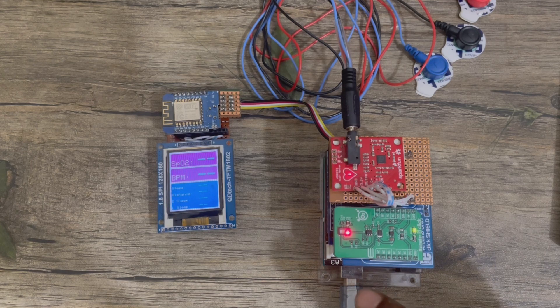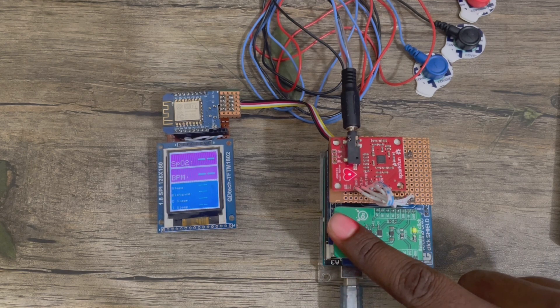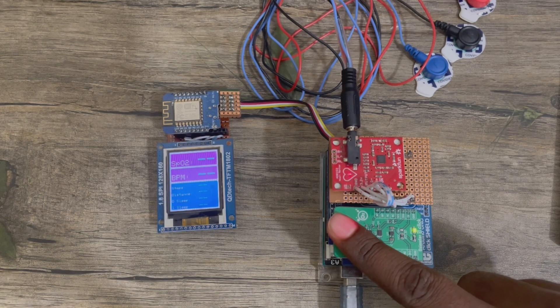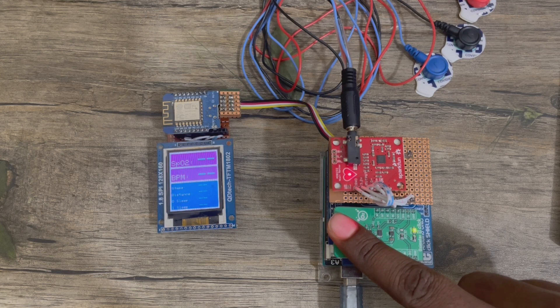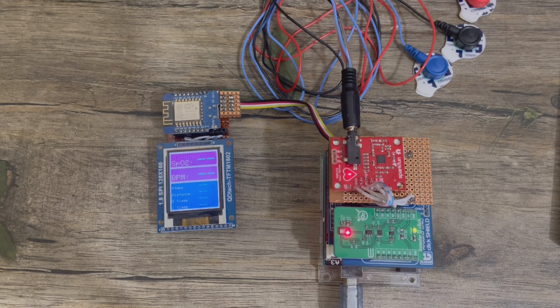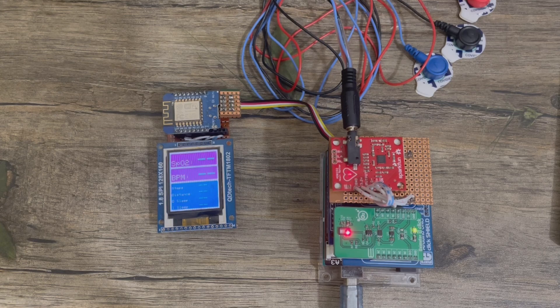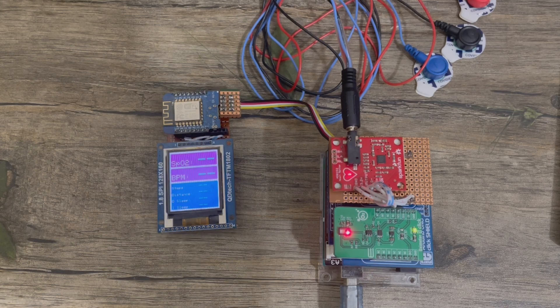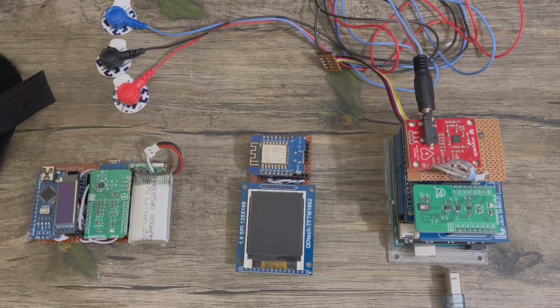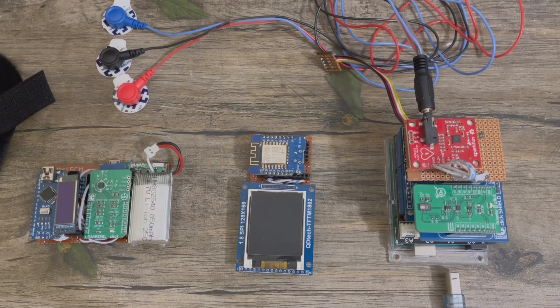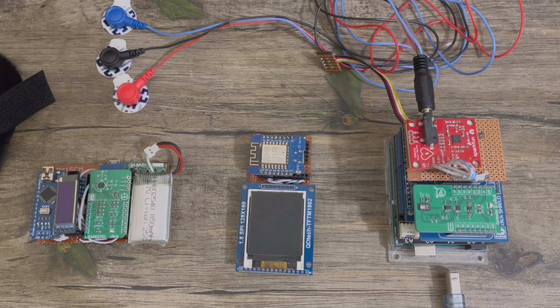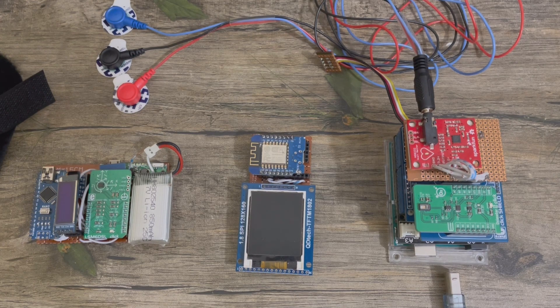If I again place my finger here, it's showing the data. This way, this is actually working. This is the full system of my remote patient monitoring system.